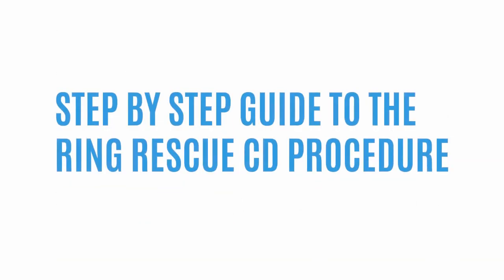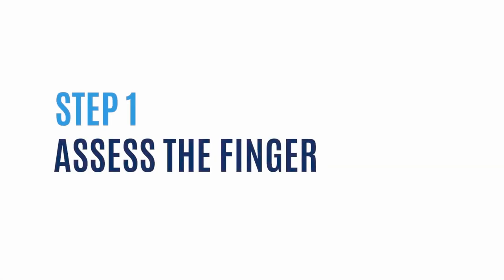Welcome to the Step-by-Step Guide to the Ring Rescue Compression Device Procedure. Step 1: Let's assess the finger.